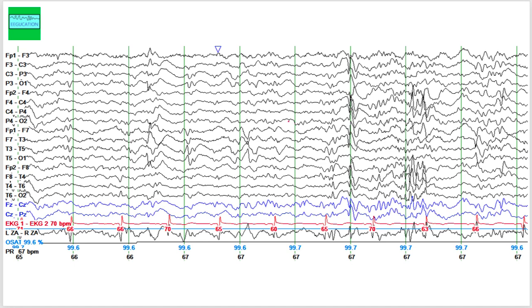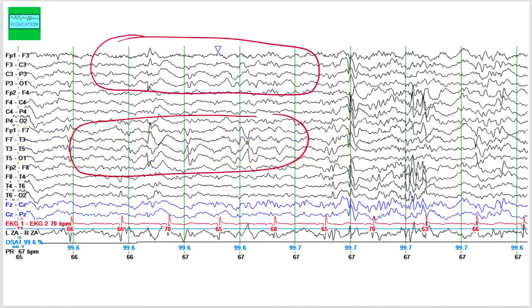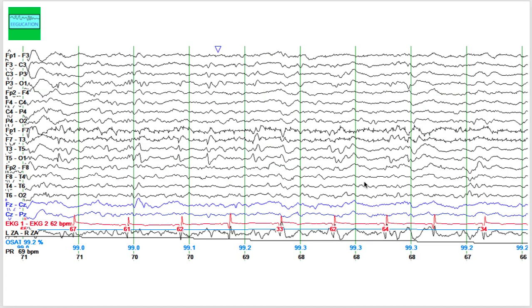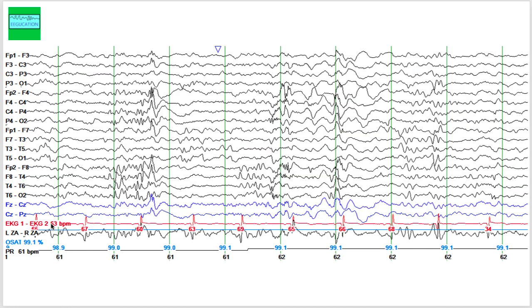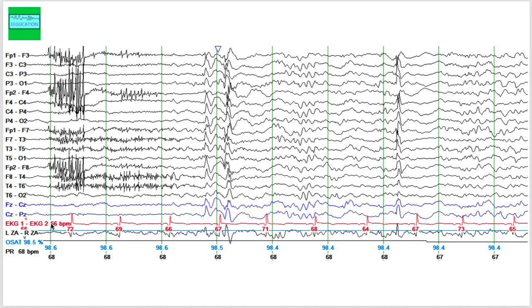On this particular page, there is a run of slowing that is more prominent in the left hemisphere — compare it with the right hemisphere — so asymmetric slowing more prominent on the left side. Then you see a burst of sharps more prominent in the right hemisphere. There is also some artifact here that is not activity coming from the brain, but the other activity on this page is coming from the brain.